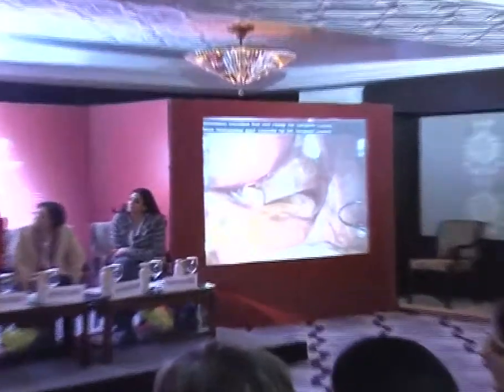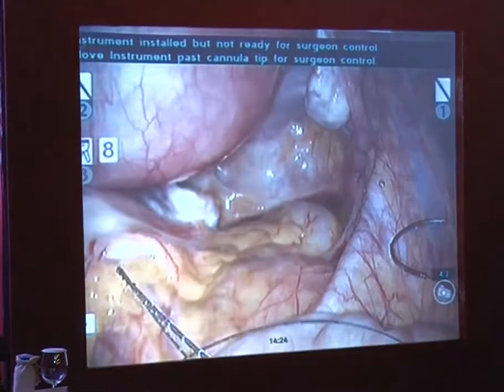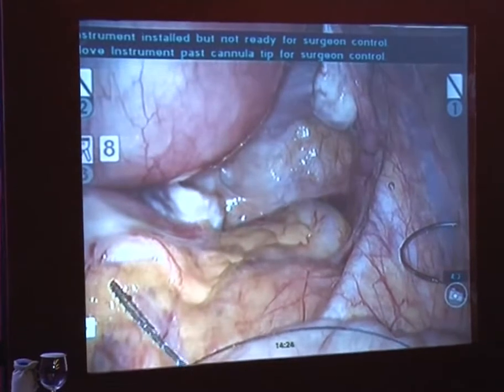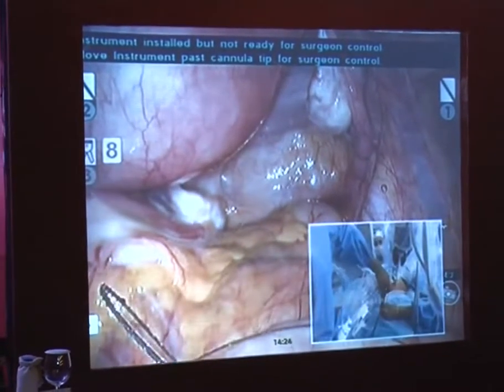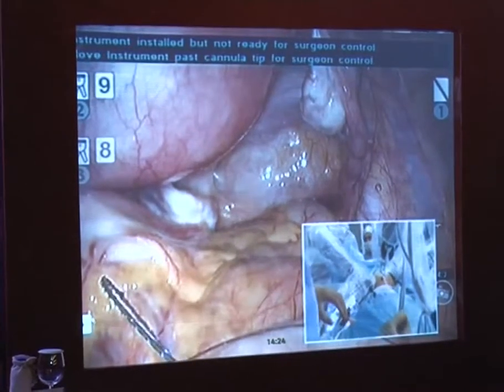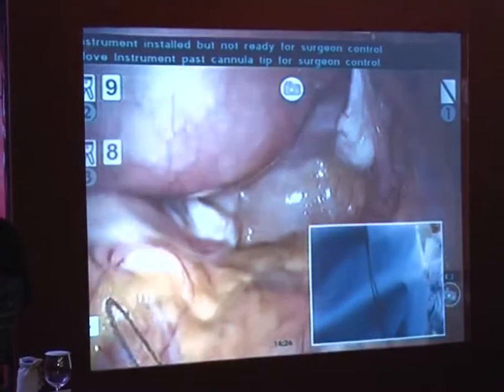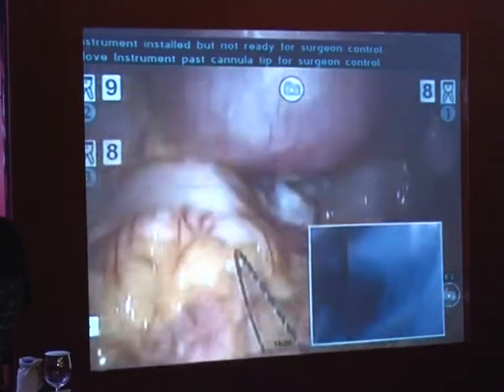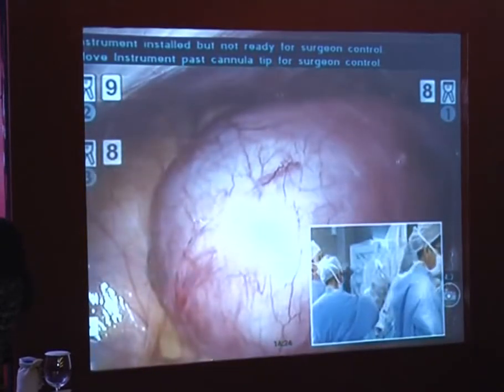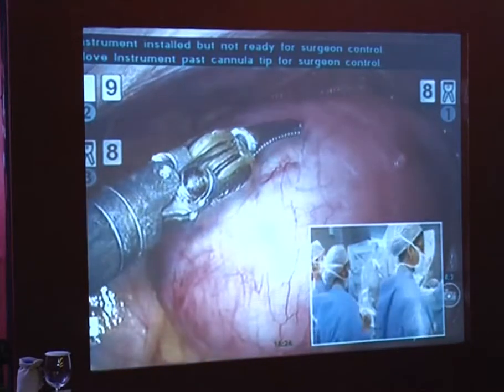Arnie, did you get the vasopressin or Pitocin into the fibroid injected yet? Pitocin or vasopressin into the fibroid before you do the myomectomy? Oh, yes. We haven't done that yet because we just got docked. We'll be doing that here in a second. All right, we're just getting our instruments all in view.